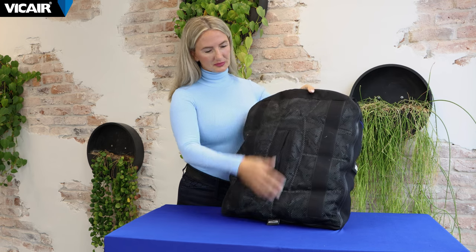In this video I will talk about the different Vcare back cushion options. The multifunctional O2 back provides excellent pressure redistribution, comfort and support. This allows the back cushion to be a perfect fit in a large variety of situations.